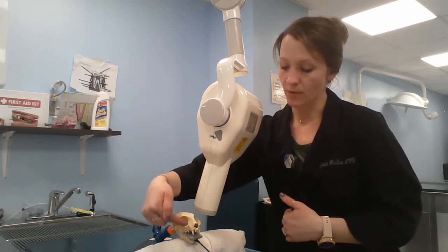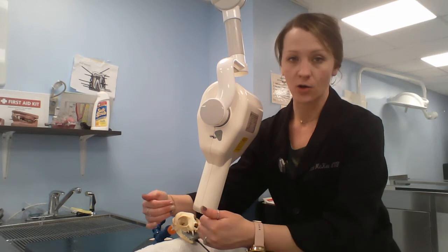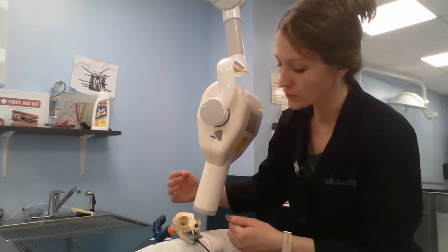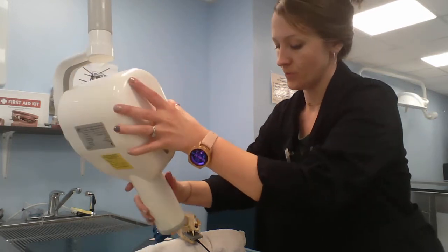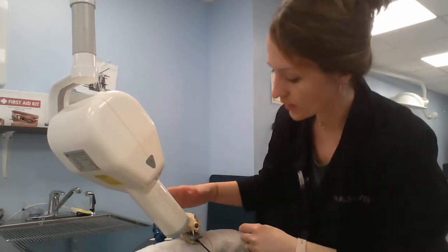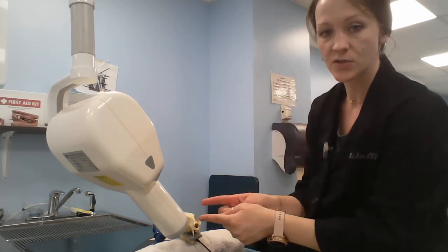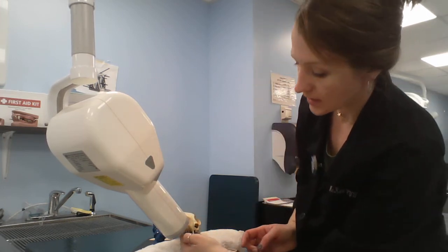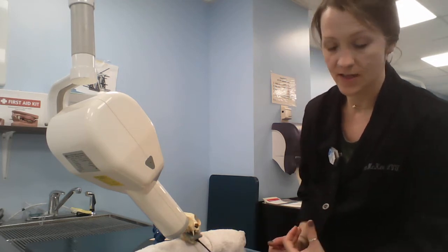To x-ray, we're going to basically do it in 3 views. We'll do one of the upper right, one of the front, and one of the upper left. We're getting the entire quadrant in one shot. So for the upper right, we're going to bring our beam over to that side. Make sure your sensor is all the way back as far as you can, and you may have to slide it to the left just a tiny bit so that it's hanging just outside. The tip of the premolar should be near the edge of the sensor.